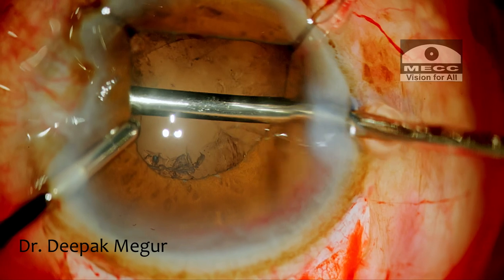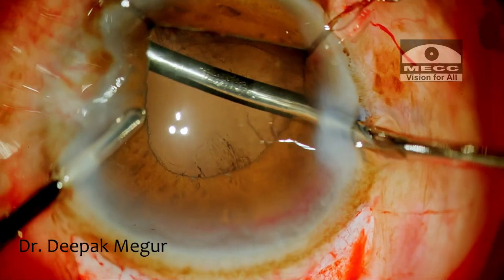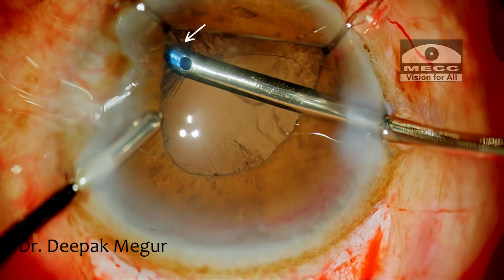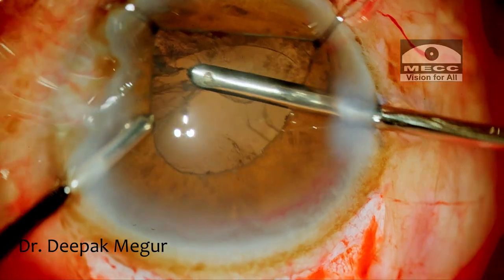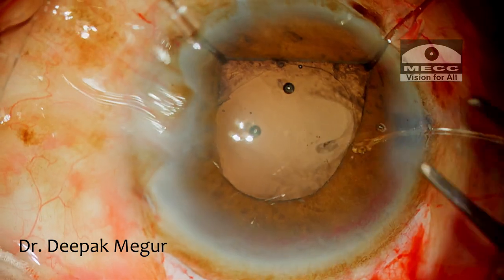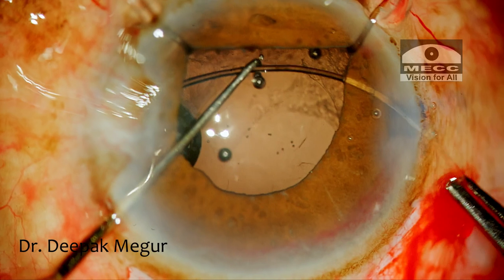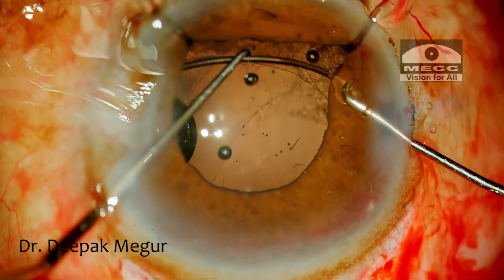Cortex extraction is an extremely challenging step in such eyes, as the bag can come along with the cortex when you're trying to aspirate it. The hooks provide excellent view so that this mishap can be prevented. Good visualization helps me introduce the CTR into the bag, which makes further steps of the surgery significantly safer.